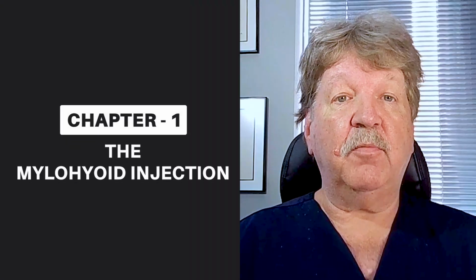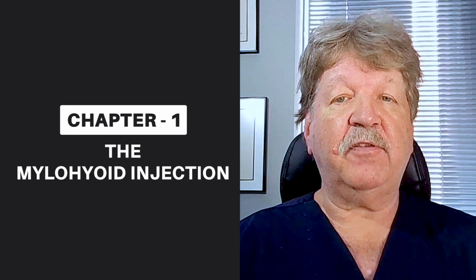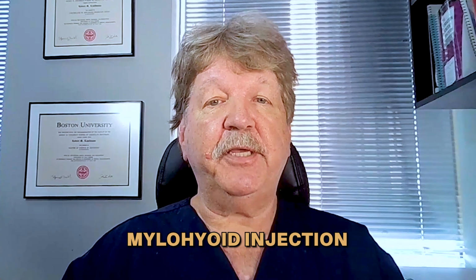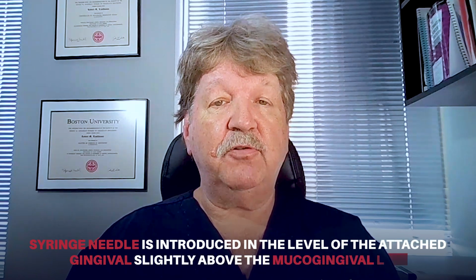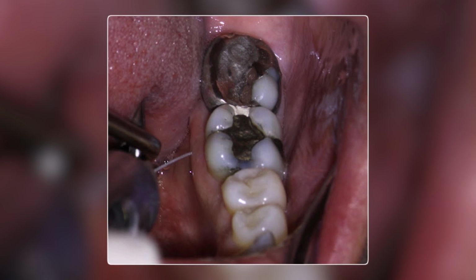In the case of the mandibular molar, we add a lingual injection or supplemental injection, and it was taught to me by Dr. Herbert Schilder of Boston University. It's also known as the Mylohyoid injection, and it frequently can deal with innervation on the lingual side of the mandibular molars. The syringe needle is introduced at the level of the attached gingiva, slightly above the mucogingival line, on the lingual side of the molar, slightly distal to the tooth that's being treated.